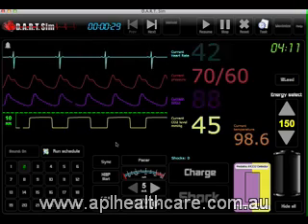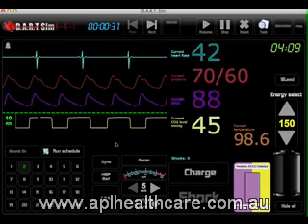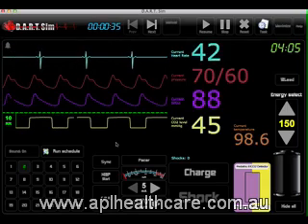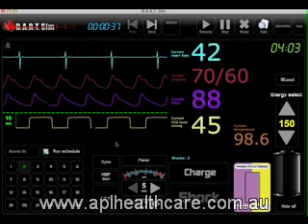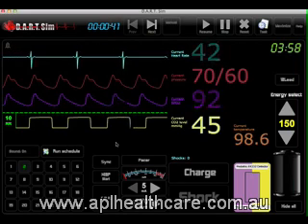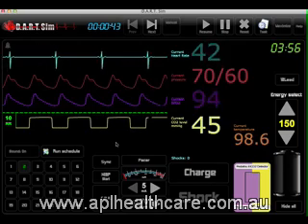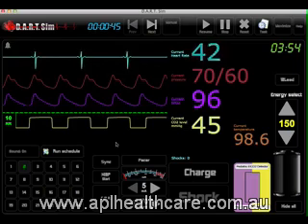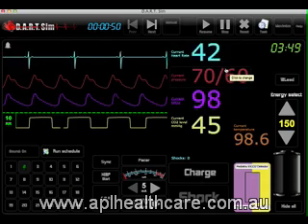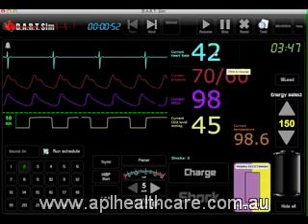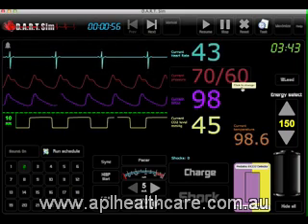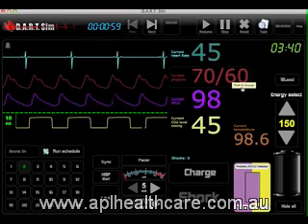If you want to adjust the SPO2, on your wireless keyboard or standard keyboard or laptop, just hold down the S key — as in Sam — and hit the plus or minus. You can adjust this depending on how well your student performs. You can also adjust the heart rate by simply holding the H key and again using plus or minus to adjust that manually.